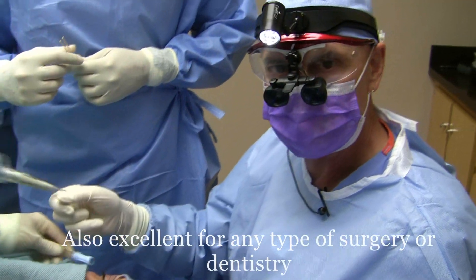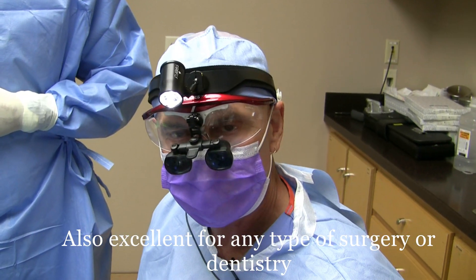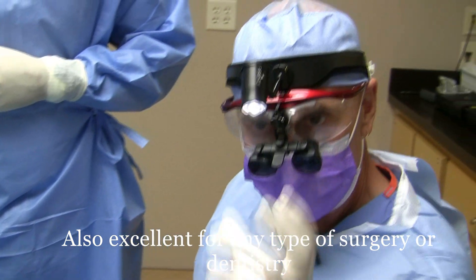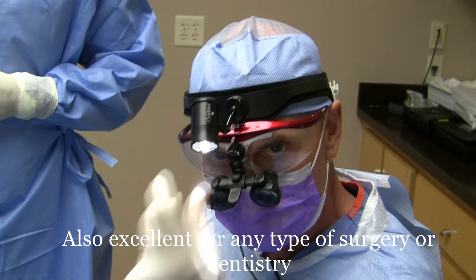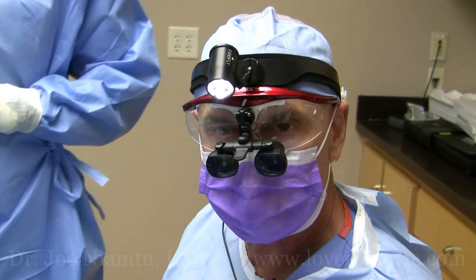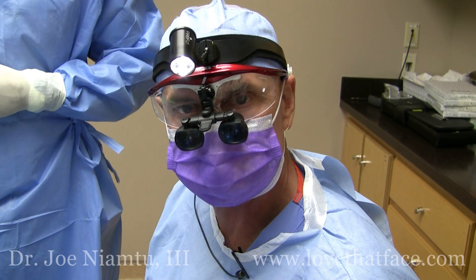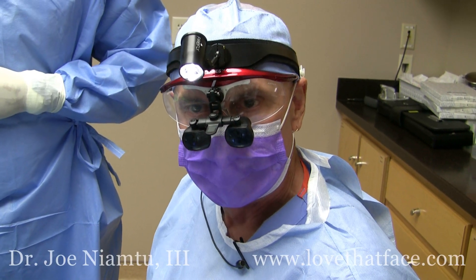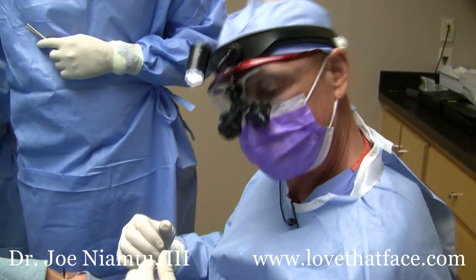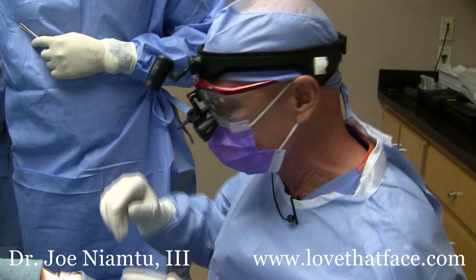So we're doing some eyelid surgery with the Denmat Firefly cordless headlight, and this is a pretty neat little thing. The whole headlight screws off and the battery and the light is self-contained. On the low setting it'll last two and a half hours; on the high setting it'll last 90 minutes. The big advantage of this is there's no cord tying me down or pulling on my headlight and requiring readjustment.